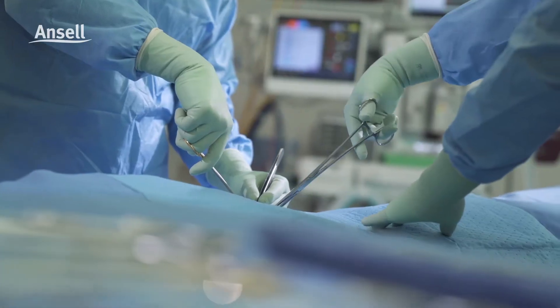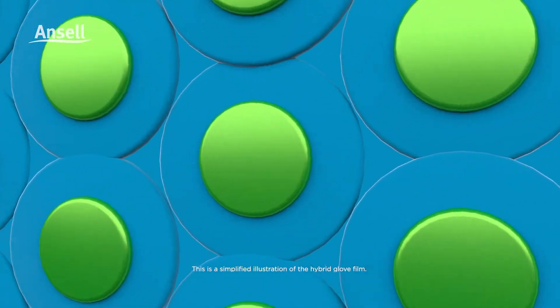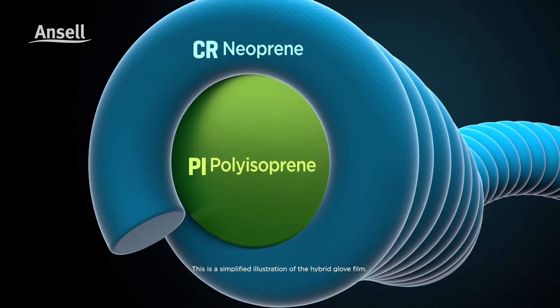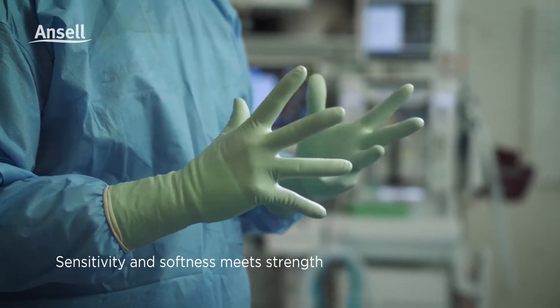Ansell's hybrid gloves have redefined the choice of non-latex surgical gloves. Made with a synthetic blend formulation, we are able to uniquely combine the best of neoprene and polyisoprene, or PI, polymers. So you get a surgical glove featuring the highest strength of neoprene and the touch, sensitivity, and softness of PI.